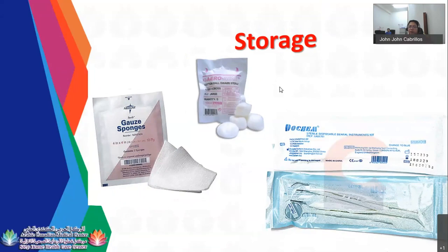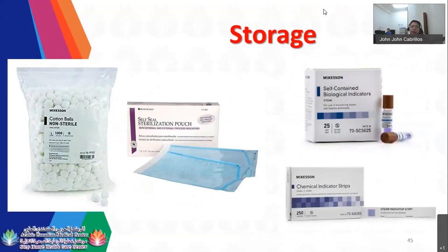So this is the sample of your non-sterile, okay? This is your non-sterile, okay? This is your cotton balls. Sometimes it will become sterile if you pouch it in a sterilization pouch and autoclave it. So it will become sterile. But if it is clean, you can store it together with the clean items or clean consumables.